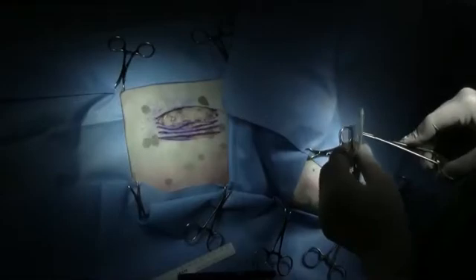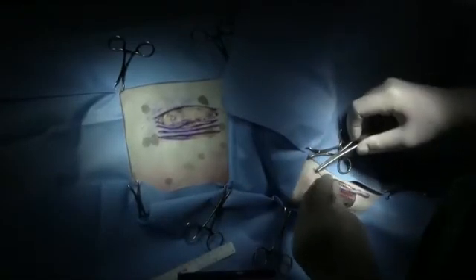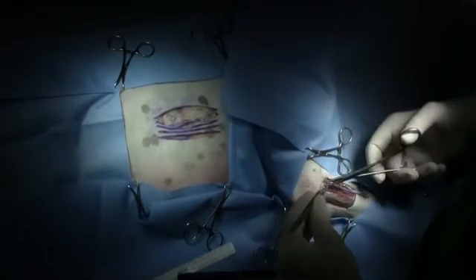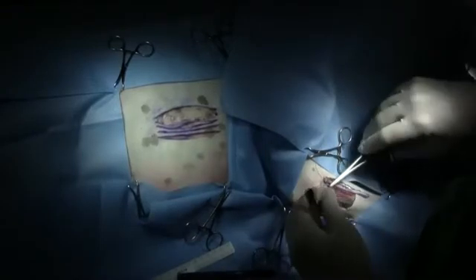At this point we can take some suture material. Generally I'll use some 3-0 suture material on a cutting needle — a reverse cutting needle. This is usually non-absorbable monofilament, either Prolene or nylon. To anchor that graft in the groove, we're going to take a bite in the area here and a bite in that graft, and that will be our anchoring suture for this graft.